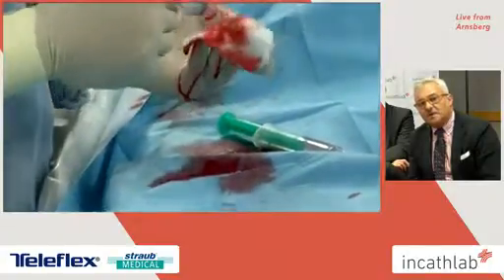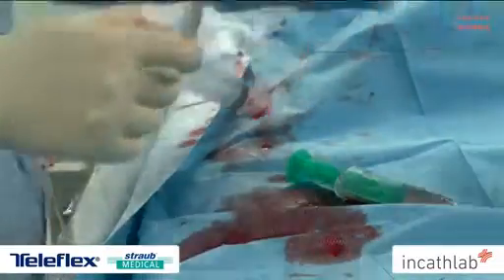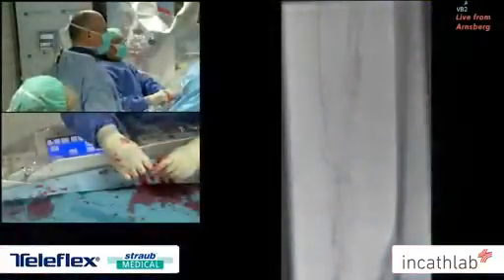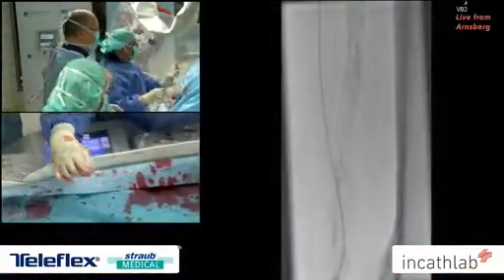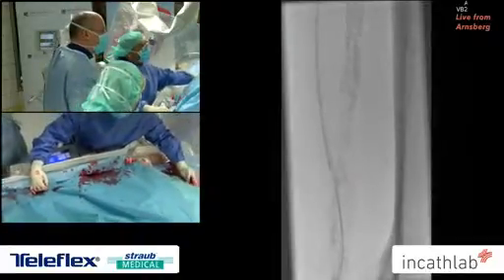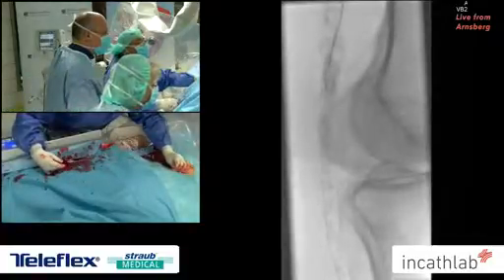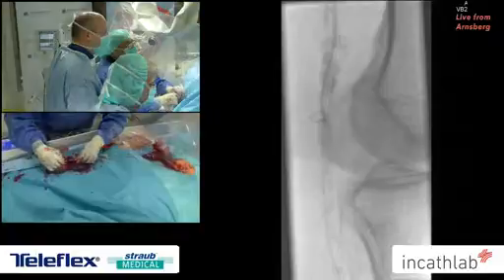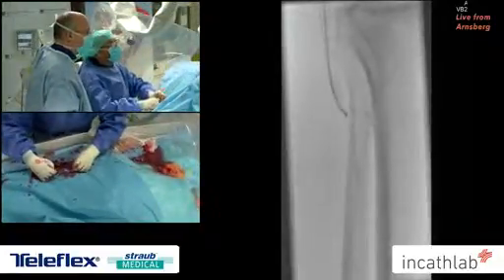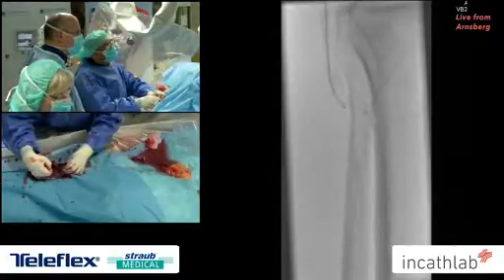Yes, we performed an aspiration after the first dilatation here, and there was some debris inside. So after the aspiration, we arrived again with the second wire in order to divide the two vessels. Treating a bifurcation is not easy.